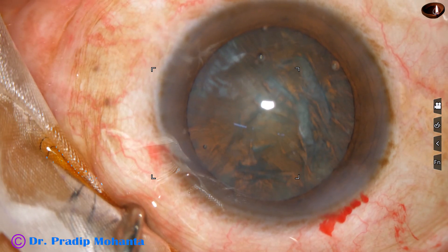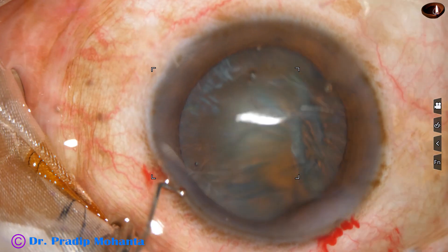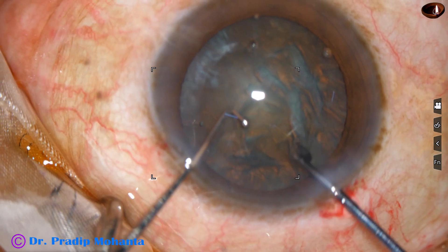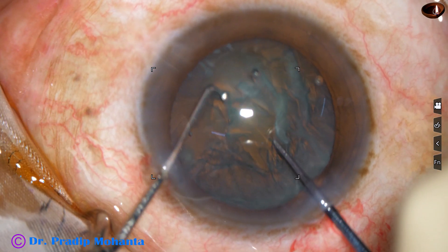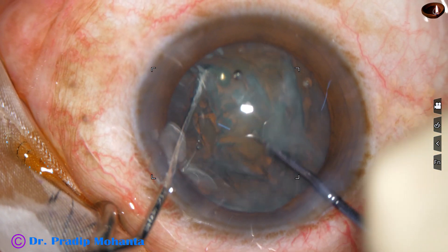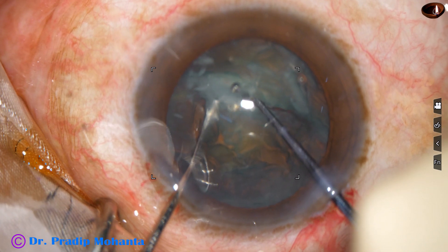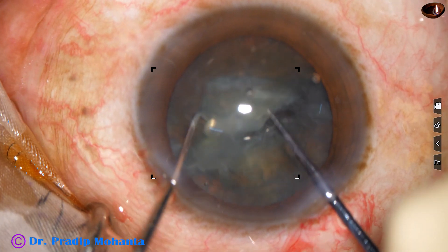Now let us see this in one third of the real speed. The pre-chopper goes through the main wound in a slant way so that it doesn't touch the corneal endothelium. The pre-chopper is embedded in the soft part of the nucleus just in front of the main wound. The sustainer hooks the other end of the equator of the lens mass. The two instruments advance toward each other and there is lateral separation and the nucleus gets divided into two hemi-nuclei.